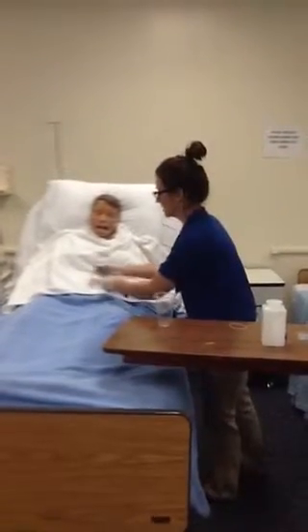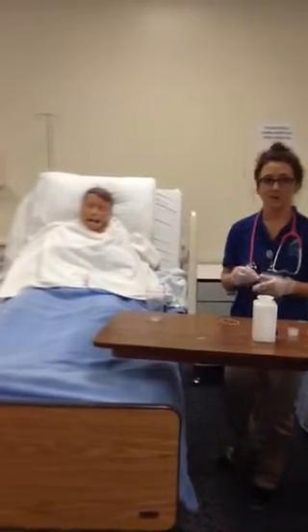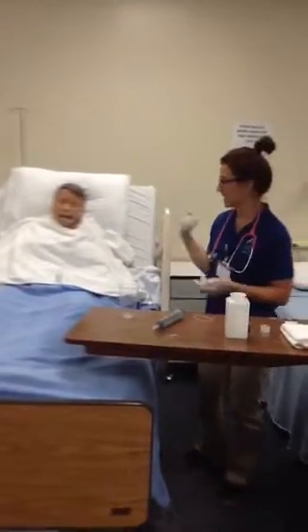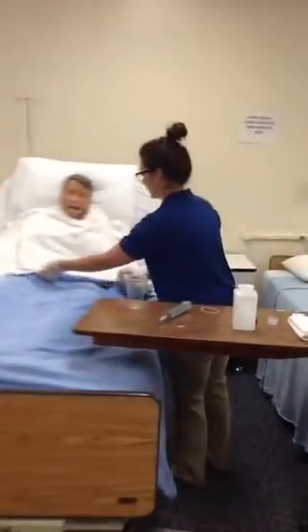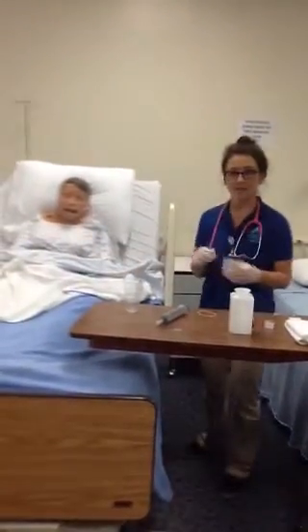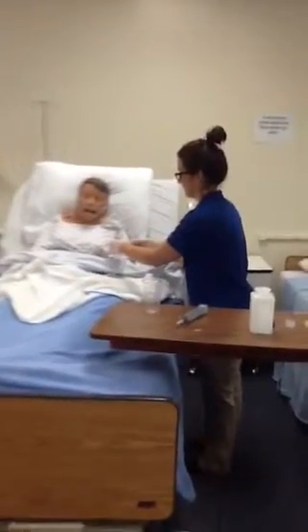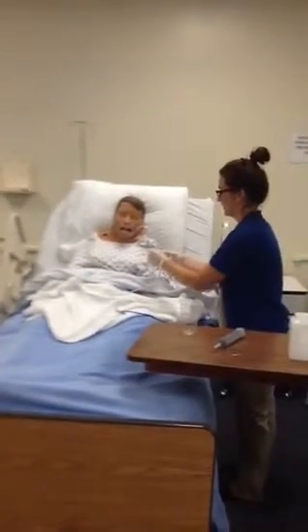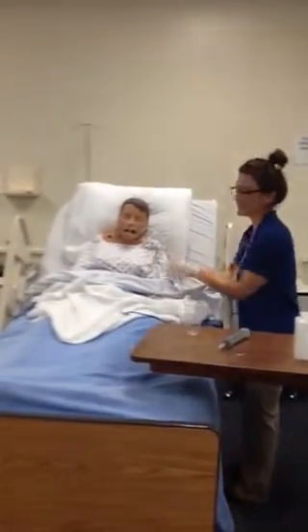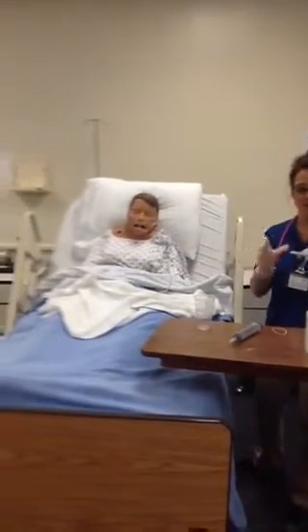For further verification, I would send, with the physician's order, Mr. Wilson over to X-ray to verify his placement. So Mr. Wilson has come back from X-ray. They have verified his placement. So now I'm going to attach the nasogastric tube to his gown. Oh, before I attach it, I need to actually tape the nasogastric tube in place since verification of placement was confirmed.